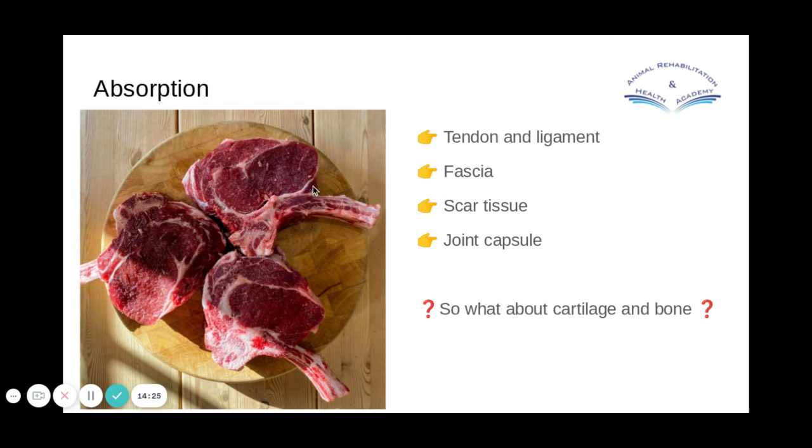Then we come down to the bone level. We're going to have some tendon around here. We're going to potentially have some ligament here around the joint and joint capsule. And then we've got the bone where we're going to have the periosteal surface, which you can see shiny here, and then into the bone. So in truth, it wouldn't go this far through to get to this bone. You wouldn't want to get to the bone, but if you were wanting to get this tendon, say, for example, you'd have to come from a different angle, which might be quite difficult. So you're not in real life actually going to travel this sort of depth through this muscle here.